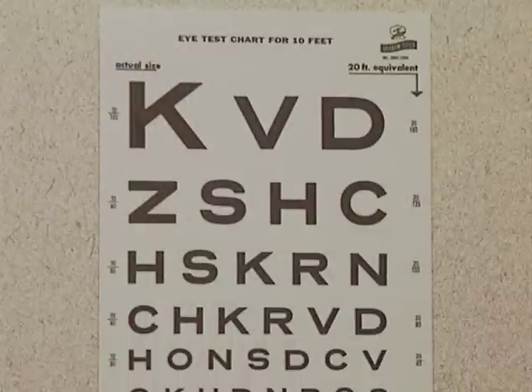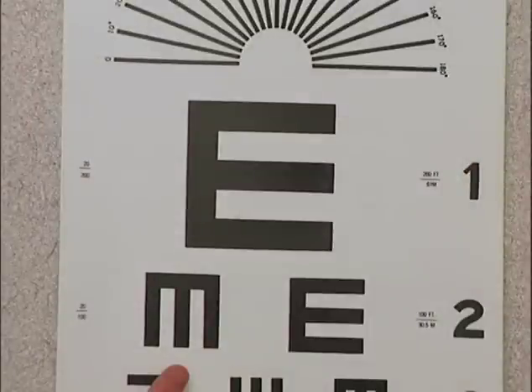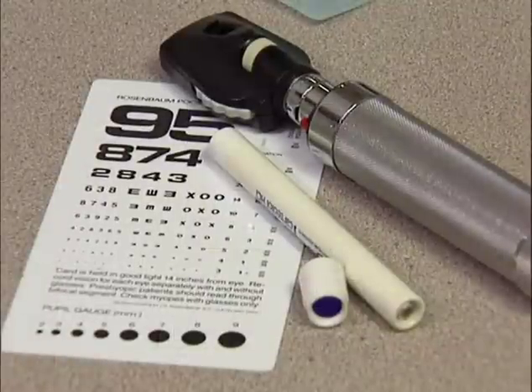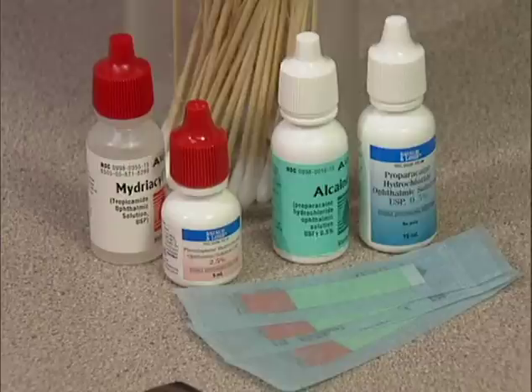To measure visual acuity, you can use either a 20-foot hallway area or a 10-foot exam room. Use a visual acuity chart, such as the Snellen eye chart, designed for either 10 or 20 feet, to match your examination area. For pre-literate children, you should have a picture chart or a tumbling E chart. You will also need a near vision card, a pen light with a blue filter, a direct ophthalmoscope, dilating drops, anesthetic drops, fluorescein strips, and cotton tip applicators.